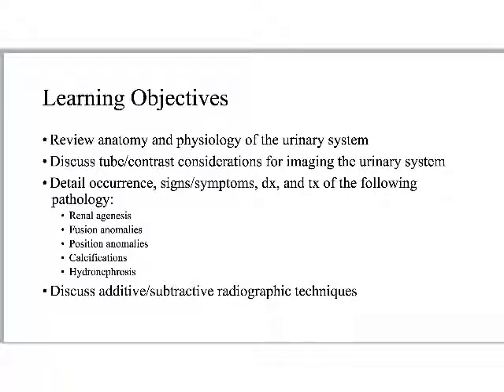The thing that you'll notice that's not on this list is a discussion of cancer. Renal cancers are pretty darn rare, and we are not necessarily frontline for diagnosis of renal cancer. CT maybe; MRI is a more likely candidate. So I wanted to focus more on the things that we see every day and that are definitely more part of our day-to-day work. And then we'll talk about both additive and subtractive radiographic techniques.